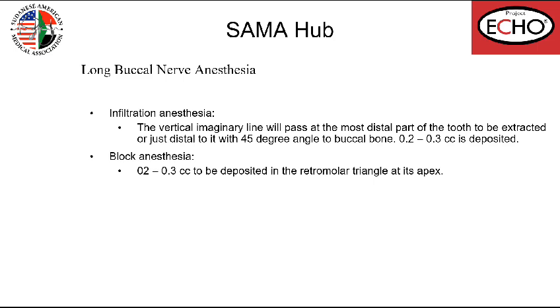If I want to give block anesthesia, it will be buccal and distal to the last molar, and the retromolar triangle at its apex.